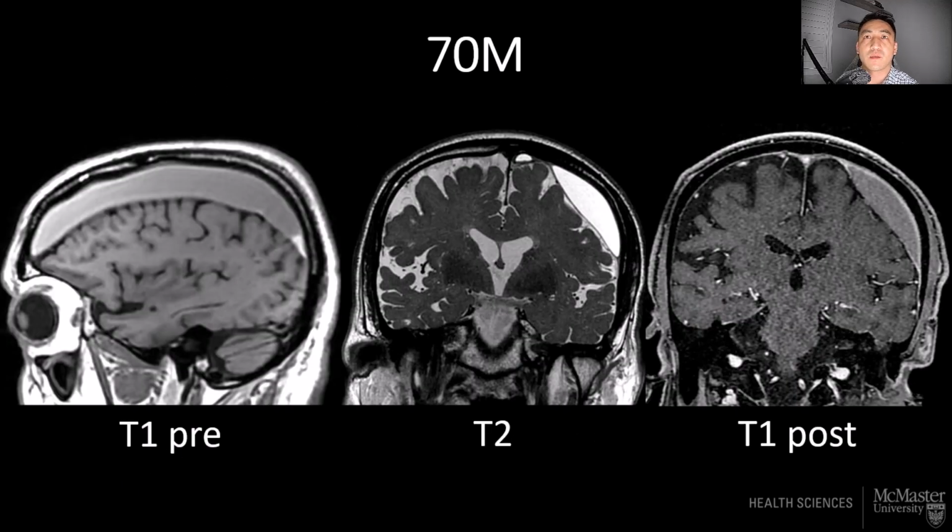On MRI, again, not reliable for age determination. There are varying degrees of signal intensity on T1 and T2 in each age category. You should see pachymeningeal enhancement, though, in most cases, if for whatever reason you did a post-gad sequence.